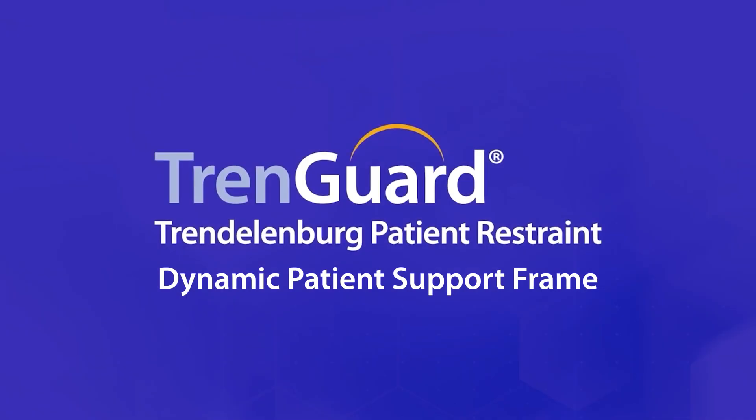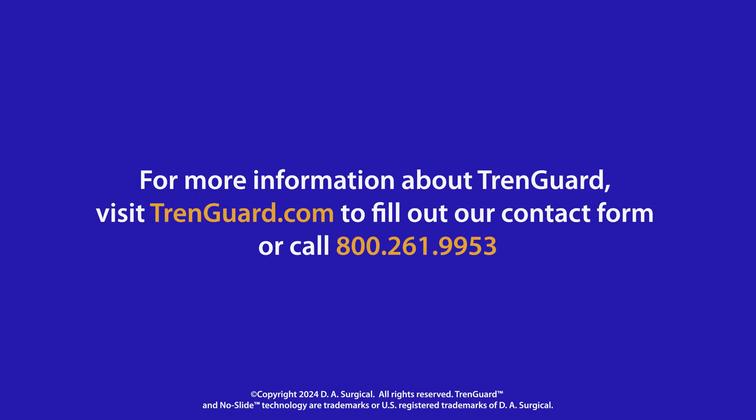With TrendGuard, positioning and repositioning patients for Trendelenburg procedures is safer for patients and staff. For more information, visit our website or call 800-261-9953.